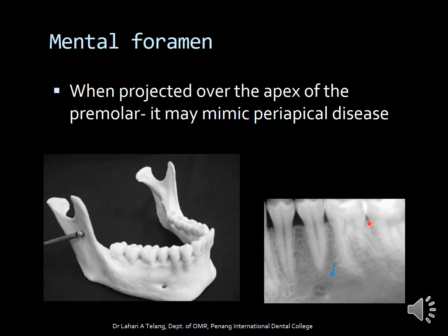The mental foramen is an important landmark — this is where the inferior alveolar canal exits. When projected over the apex of the premolar region, it may mimic periapical disease. It is therefore important to note that the mental foramen is located somewhere between the premolars and is sometimes in very close proximity to the apex of the premolar in the mandibular premolar region.